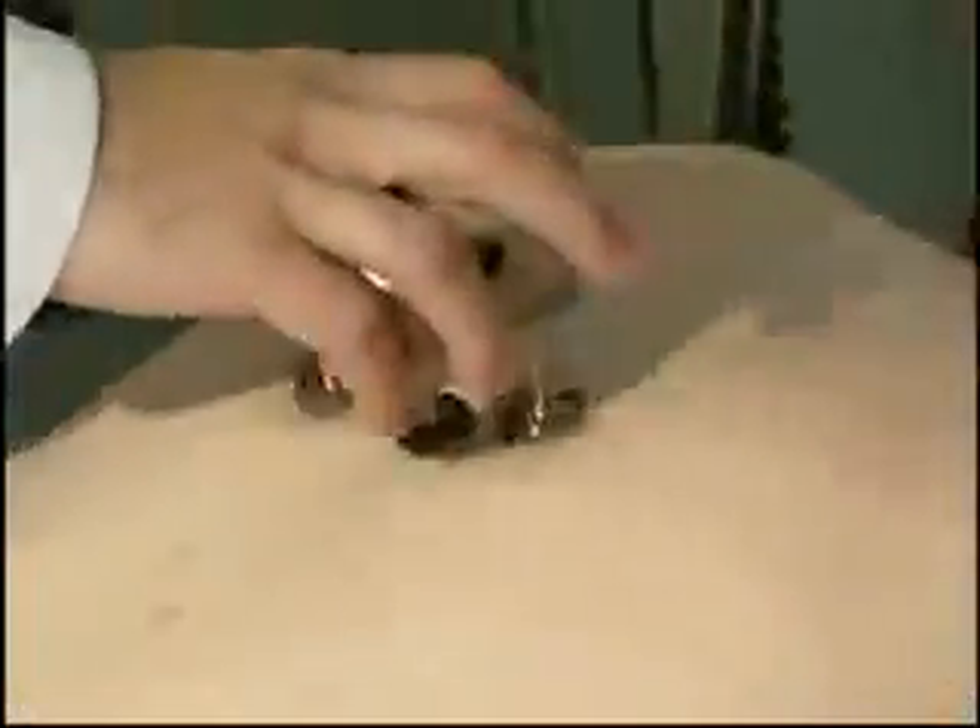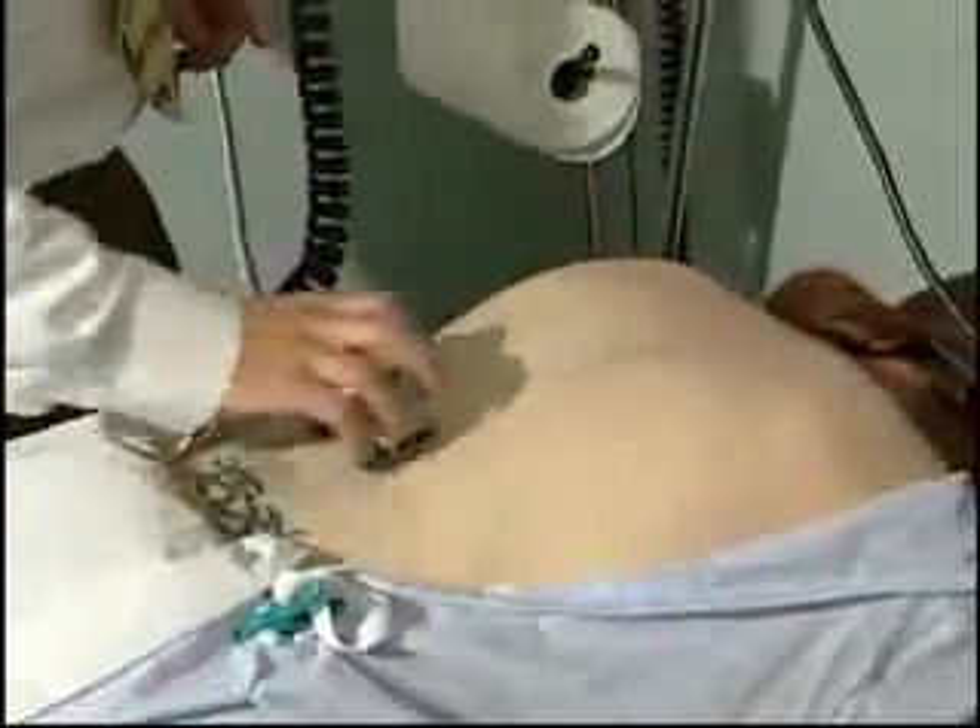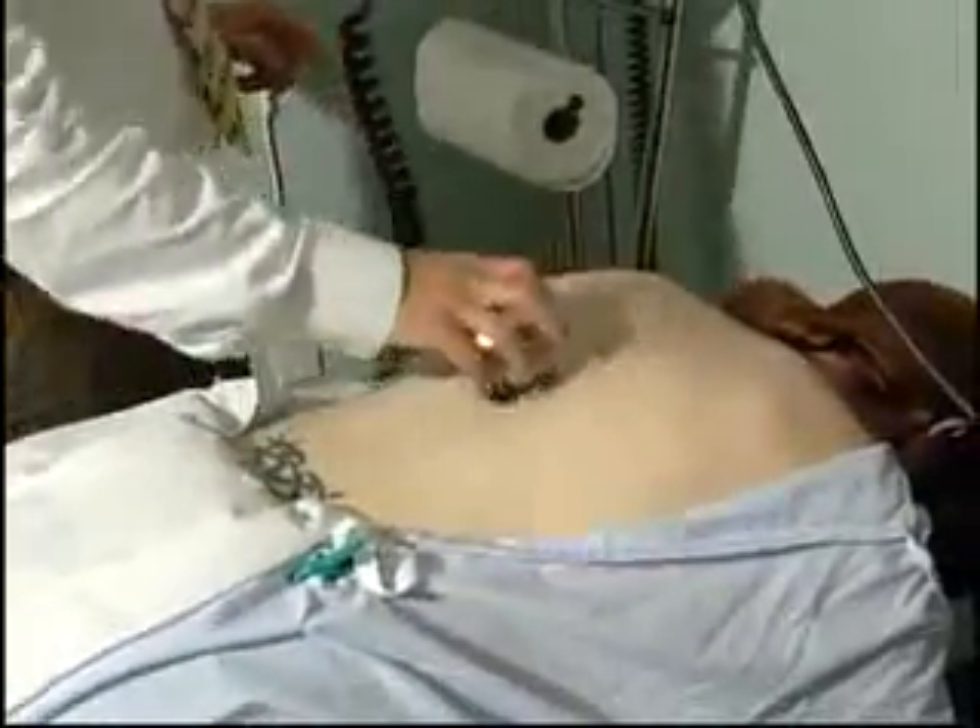There are three components to the treatment. The first is the spasm component. It basically just prepares the tissue — it goes up and down along the spine and helps to release some of the spasm. We'll do a little abbreviated version here.